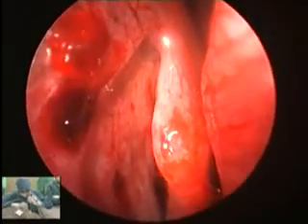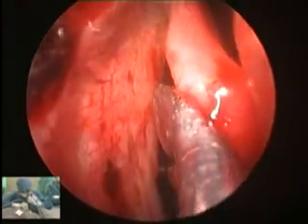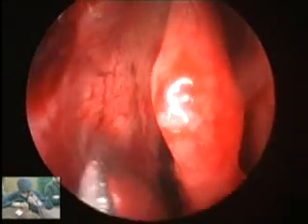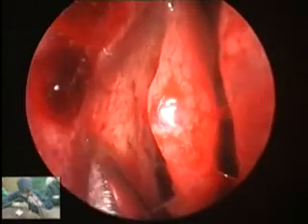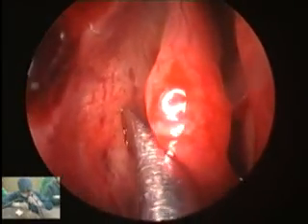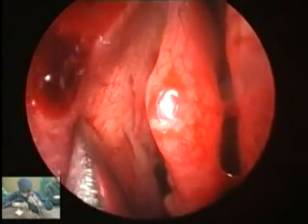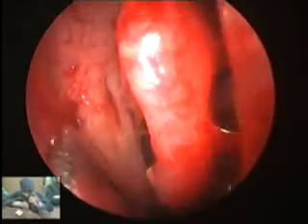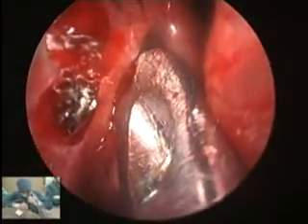Sham, just palpate and see if we can see where the insertion of the uncinate is on the lateral nasal wall. If you were going to use the traditional technique, where would you make your incision? Here. There, okay. You see, this is quite hard. So the main bulk is here, and the incision I will make will be somewhere there, along here. Here.